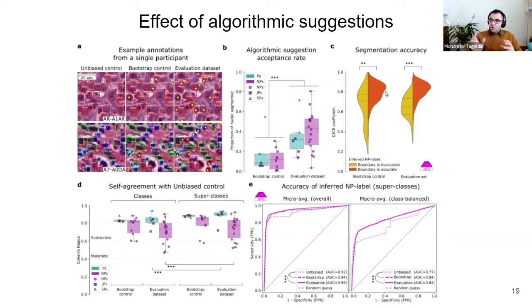And the way we validate this is we have a limited data set where we ask someone to do everything manually, every segmentation boundary manually as a pathologist, so that we can actually show that even the ones they do click are more accurate than the ones they don't click. So they do have a selection pressure, essentially.